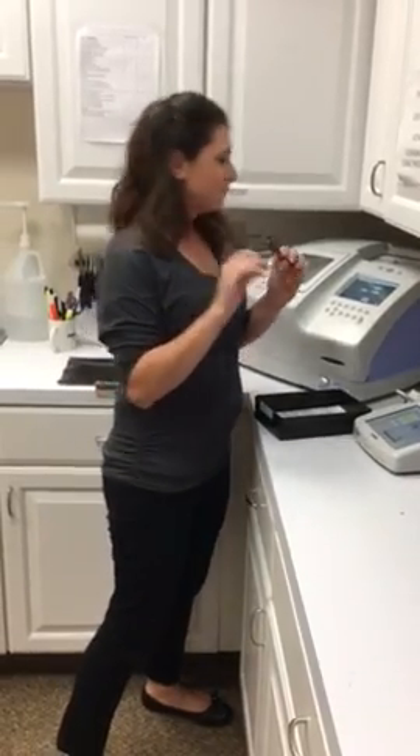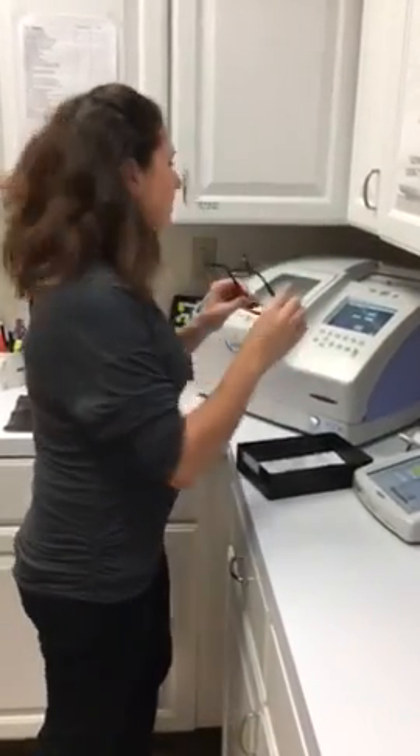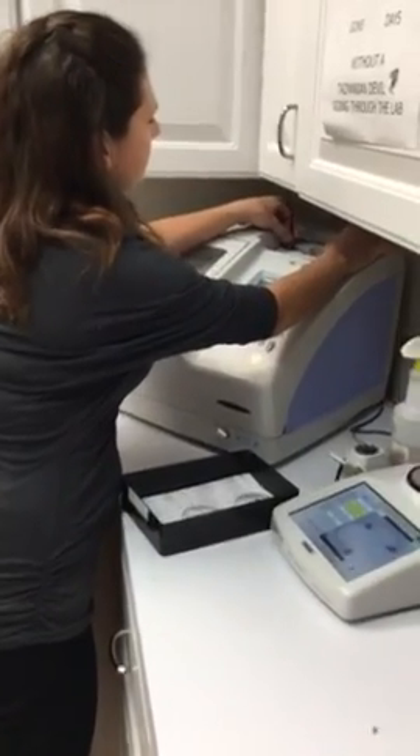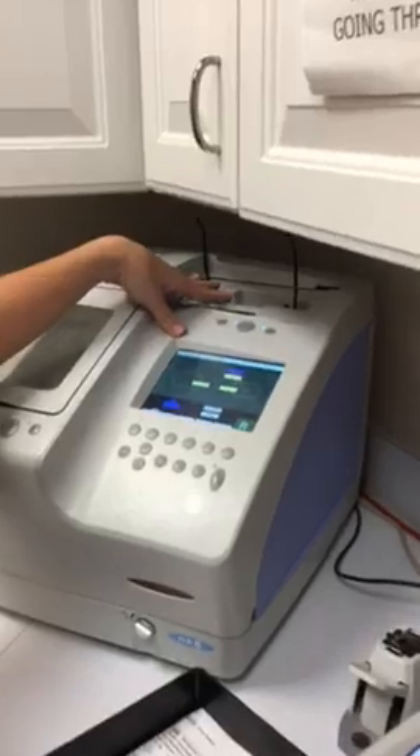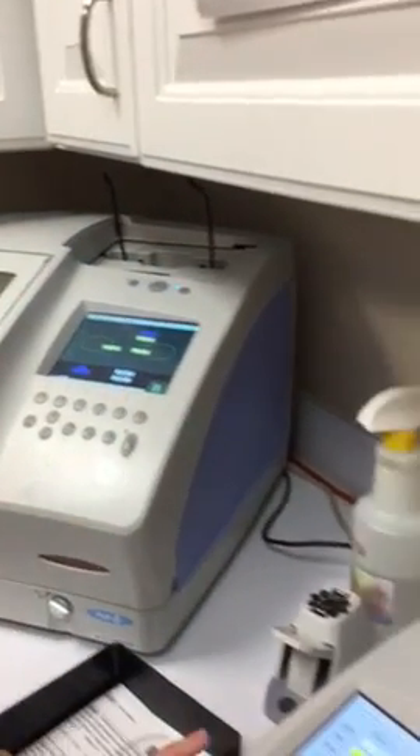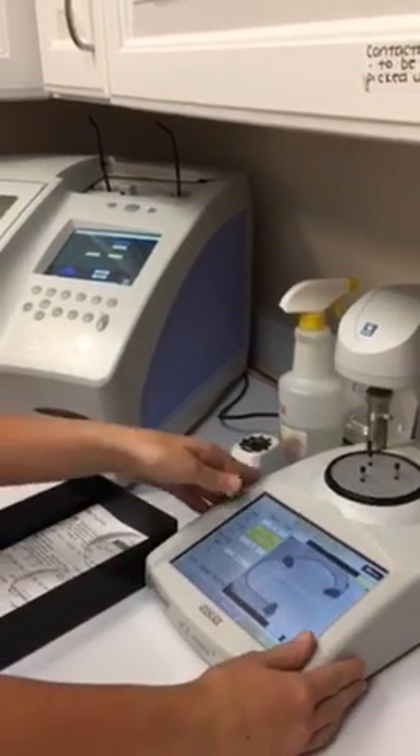So right now I'm going to take the frame, tuck the demo lenses out, and put it here in our tracer. This traces the pattern of the frame, and it takes the information here and transfers it to our blocker right here.